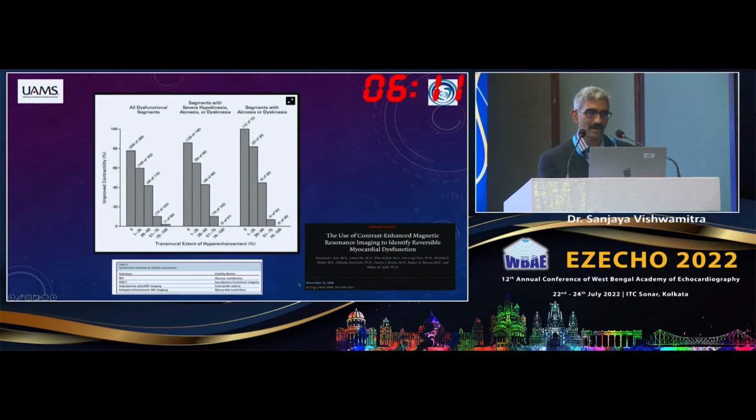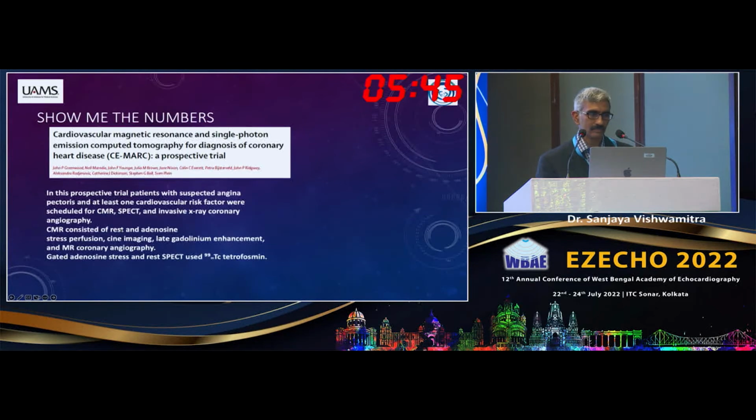Again, the seminal article back in 2000 also showed that if the infarct was less than 50%, these patients had significant improvement in their contractility after surgery, as compared to patients who had scars of greater than 50%, who had substantially poorer improvement in the same region. So this is what really helped us make the diagnosis.